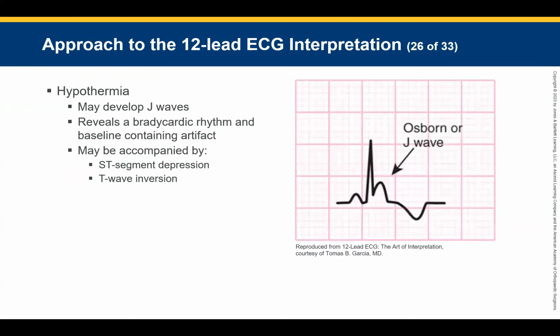That's doctor stuff. When we get people that are super cold, hypothermia, they call this a J wave. I don't like the extra letters, but you get an extra little bump there on the backside of the QRS before the T wave. You may get T wave inversion. Really just means you better be careful with that really cold person. Really, really cold people can go into cardiac arrest.